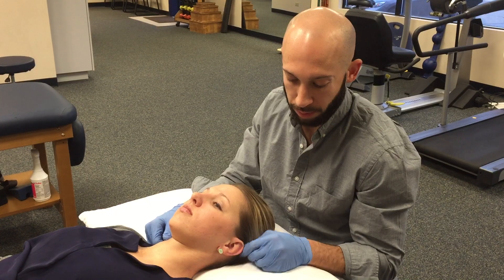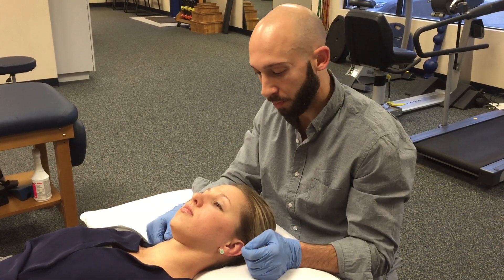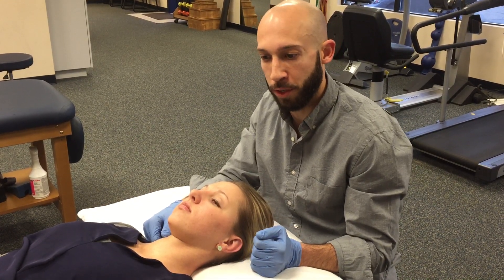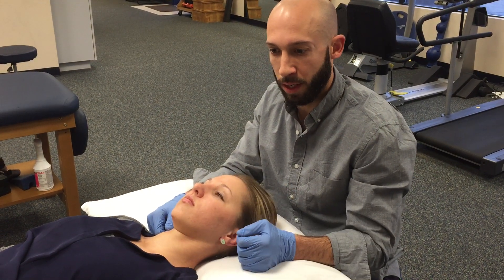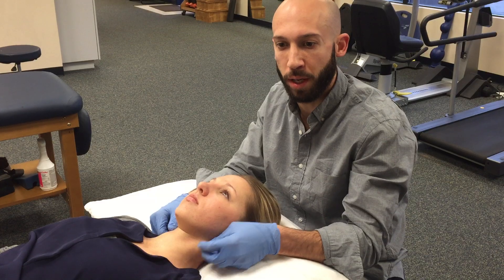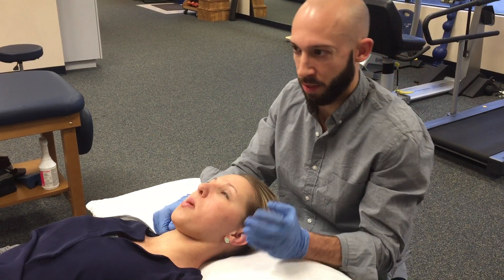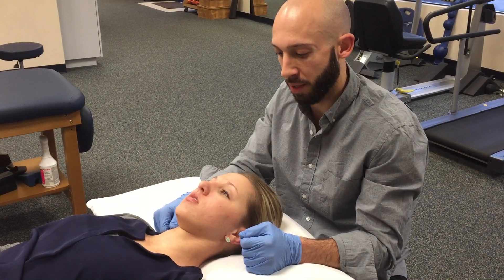Patients can also complain of pain in the ear or behind the ear. Those are the most commonly reported referral patterns for the SCM, although patients may have more vague symptoms anywhere around the head or face. The key point is to identify the trigger point and see if palpation of that refers to their head. We'll go by a step-by-step process of identifying these trigger points in the SCM.